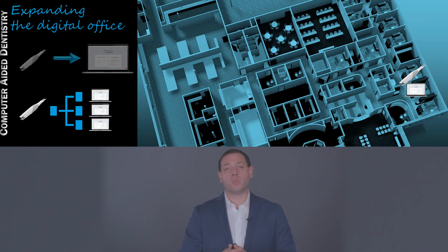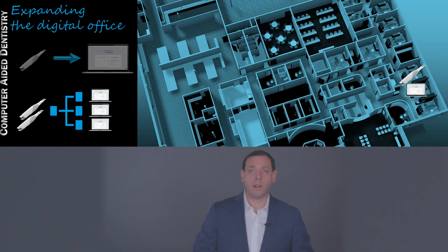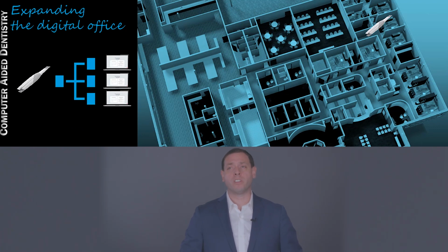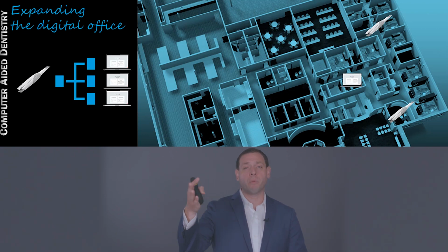We have the ability to have these systems communicate very similar to some other client-server relationships, where we can now view these scans not just on that scanning computer, but in different areas of our office. And here's how I like to simulate that. We have a scanner that travels around through the office, and we have a scanner that's built into our scan room. Sometimes when we're presenting a treatment plan, we want to have that 3D information available to show the patients.